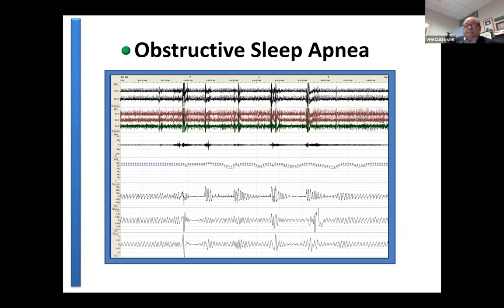So Magnus was the first one to point out these sorts of things. You have these patients that are breathing along perfectly fine, as this gentleman is at the beginning, and this gentleman is going to go on after this series of 1, 2, 3, 4, 5, I don't know. What do you want to call them? You want to call them apneas? You want to call them wibbles? What do you want to call them?